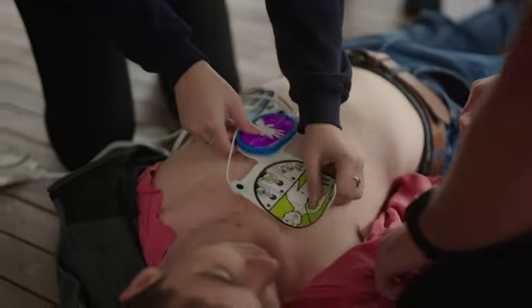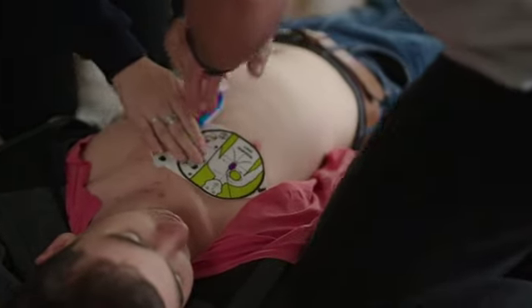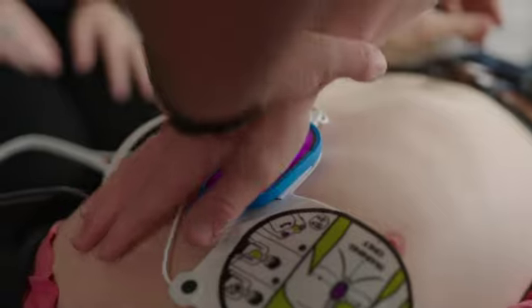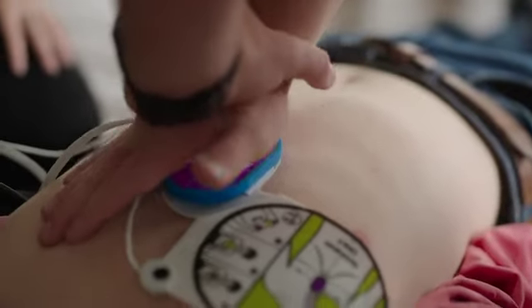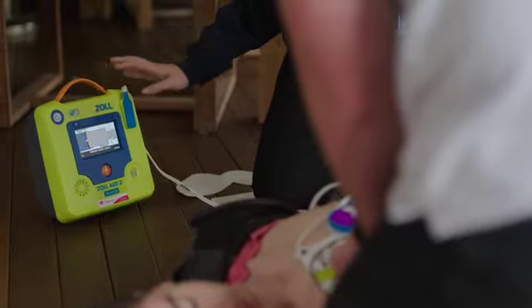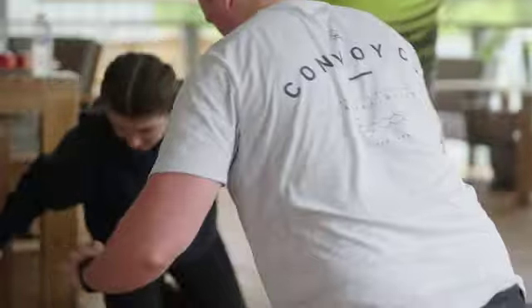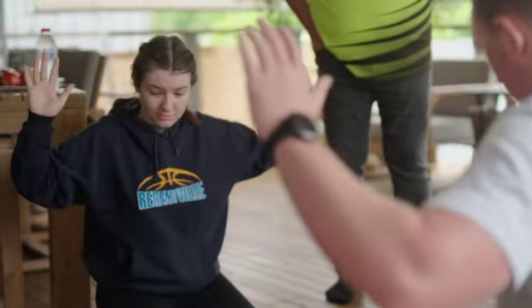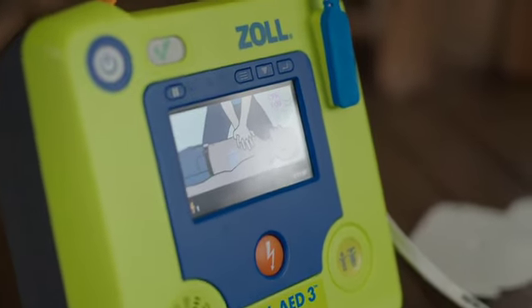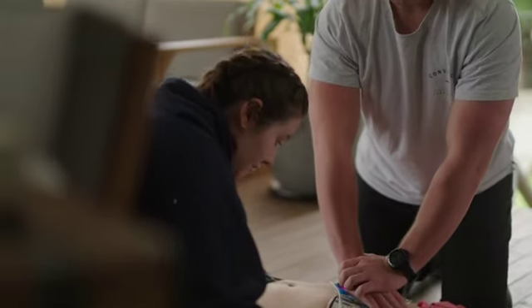The defibrillator will advise when it's about to shock. If you have a fully automatic defibrillator, it will automatically deliver the shocks, or there may be a button that you have to push on a semi-automatic mode. Remember, keep going, swap over operators, that's CPR operators, at every 2-minute interval that the machine tells you to stop, and utilise bystanders, family members, colleagues, etc.